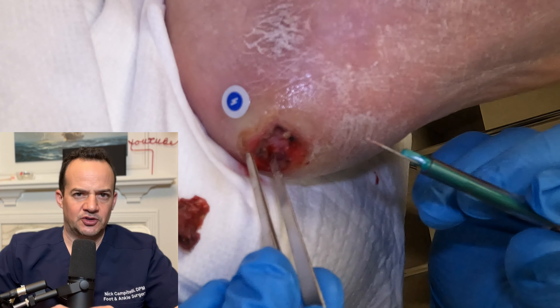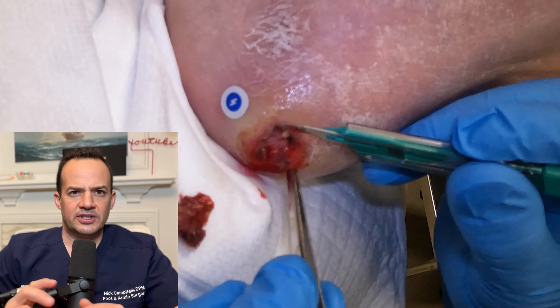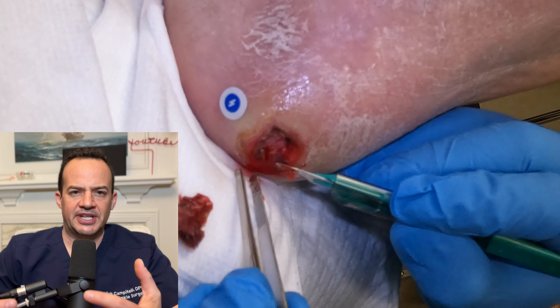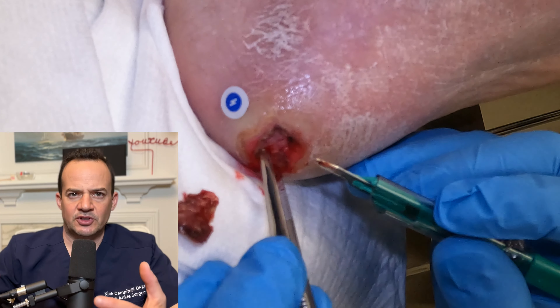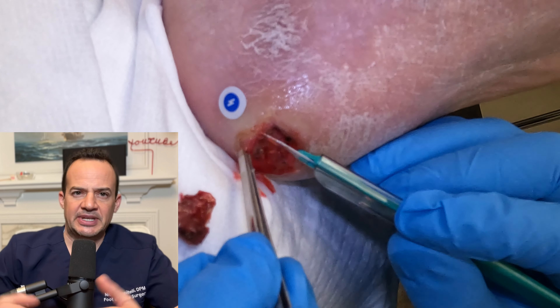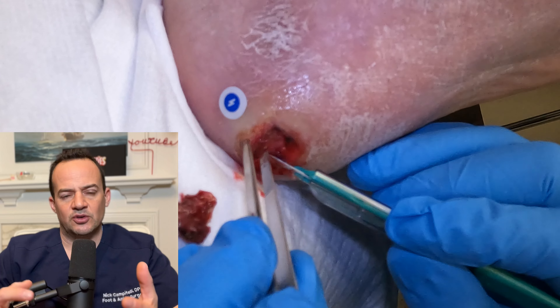So why do we cut away this tissue? Wounds in these types of patients become chronic and start to form dead, unhealthy tissue, and that stops the good tissue from forming. By cutting it away, it actually speeds up the healing process so that we can get the wound to heal faster.